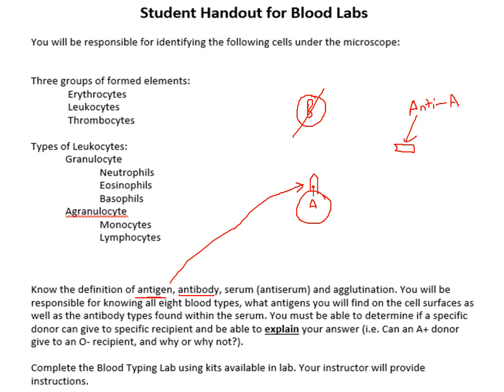If I told you, yeah, I like football, but I am anti-Gamecocks, or I'm anti-Clemson or whatever. Hope I don't upset anybody with that, but as long as it says anti in front of it, it tells you what it doesn't like. So if I've got an antibody called anti-A antibody, it doesn't like A antigens.